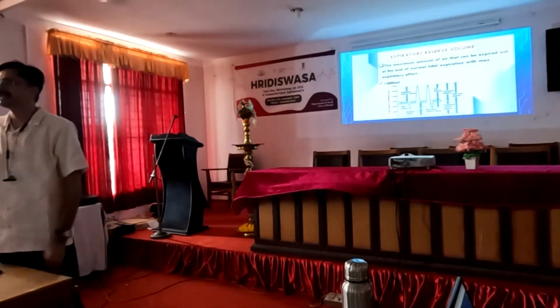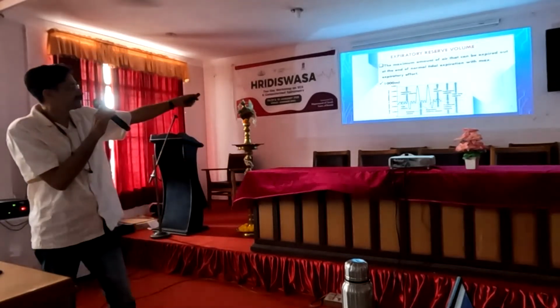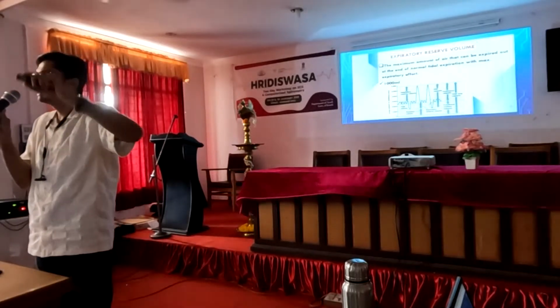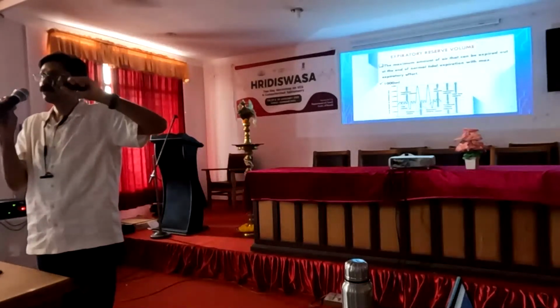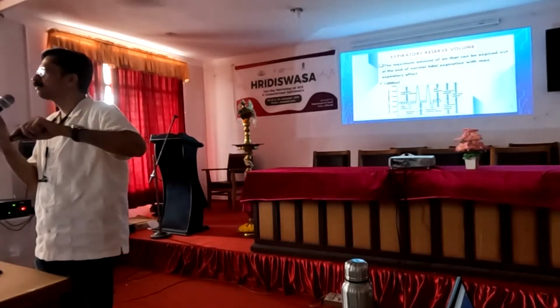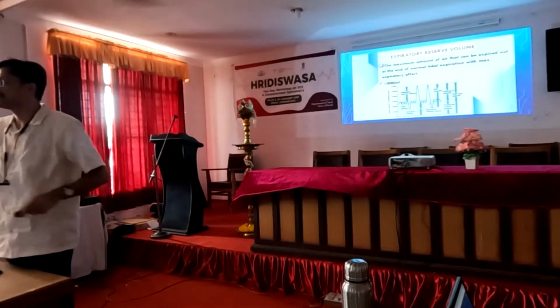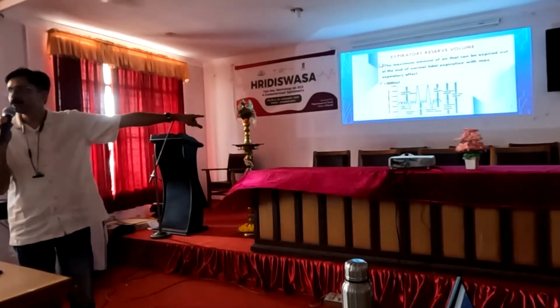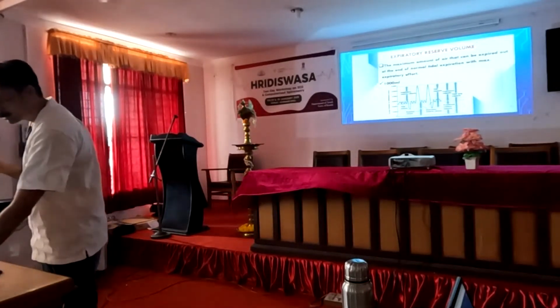Next is the expiratory reserve volume. Here the same thing in the expiration. The maximum amount of air that can be expired out after normal tidal expiration. That is the difference. Inspiratory reserve volume is the additional volume taken after the normal tidal inspiration, but in the expiratory reserve volume, the maximum expiration takes place after the normal tidal expiration. That is the downward deflection that we can see. That is expiratory reserve volume. Normal is 1000 ml.